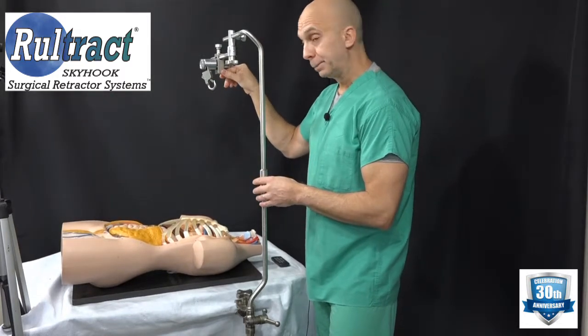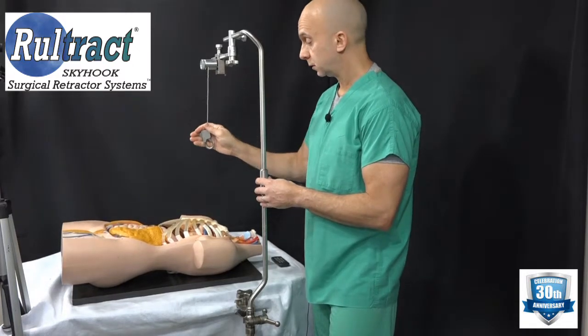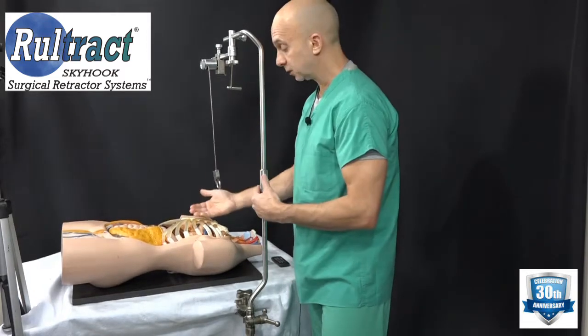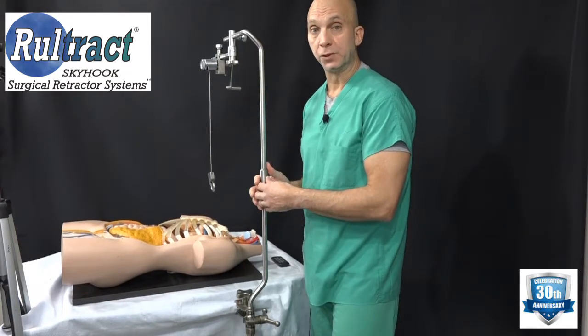Flip the ratchet lever and pull the snap clip down. Attach your desired attachment to elevate the sternum, and you are ready to use the Roletracked for the NUS procedure.